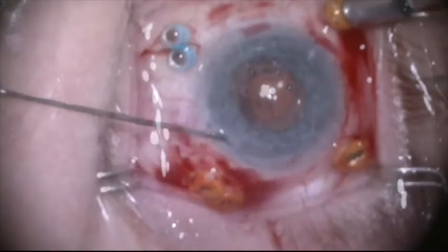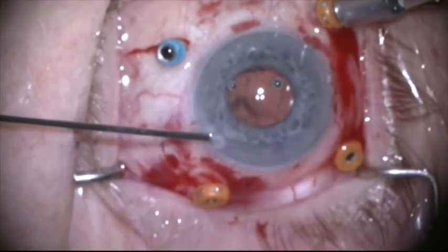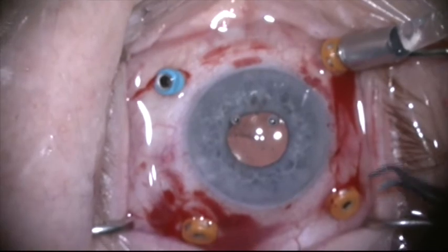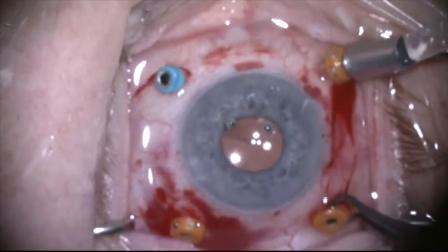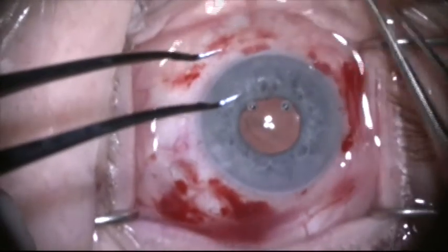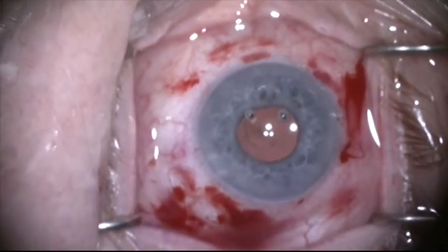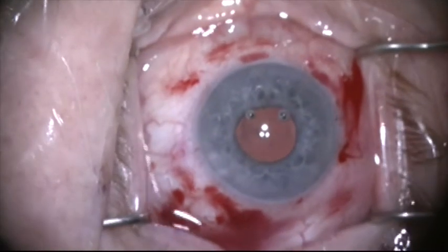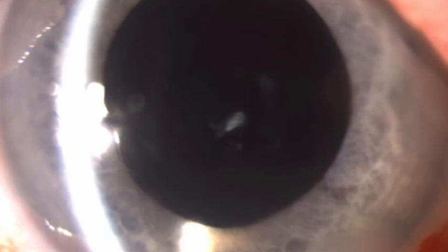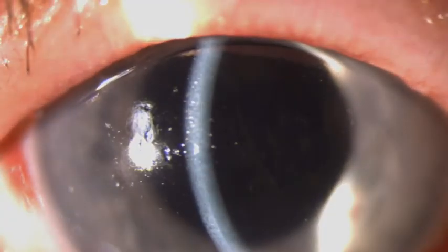The lens here is pretty nicely centered. I'm going to make a little peripheral iridotomy with the vitrector to prevent reverse pupillary block. I'll remove my trocars and the case is completed. I saw the patient a few hours later in the office and she looked like this at the slit lamp — her vision was 20/50 uncorrected and the cornea was nice and clear with a very well-centered lens. Thank you for your attention.